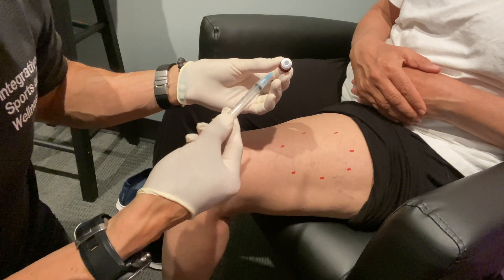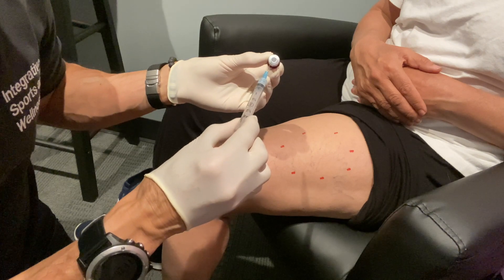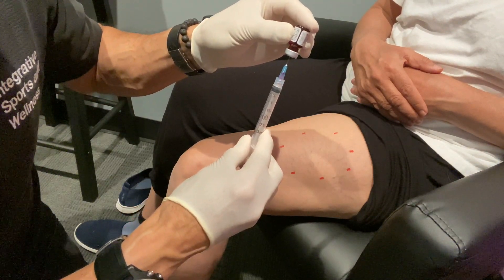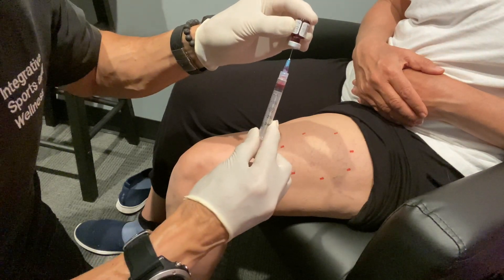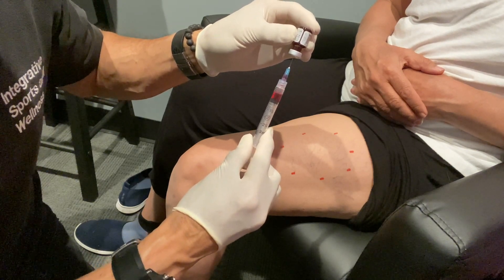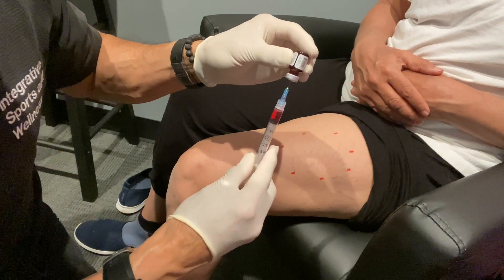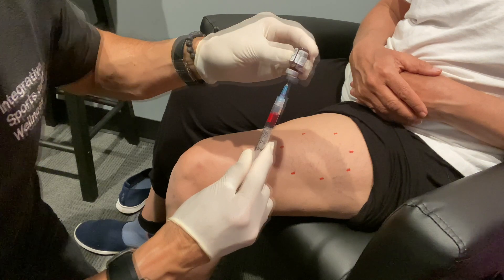That rubber stopper has a hole, or at least a circle in it, with raised edges — that's where the needle is going to go into. I turn it this way just to enter the needle into the vial. Sometimes you can pull and inject a little air so there's some pressure that comes out. As I mentioned last time, you noticed the nurse pushed in air first. That makes sense, but I did that once and put in so much air that the top popped off, and I got splashed.